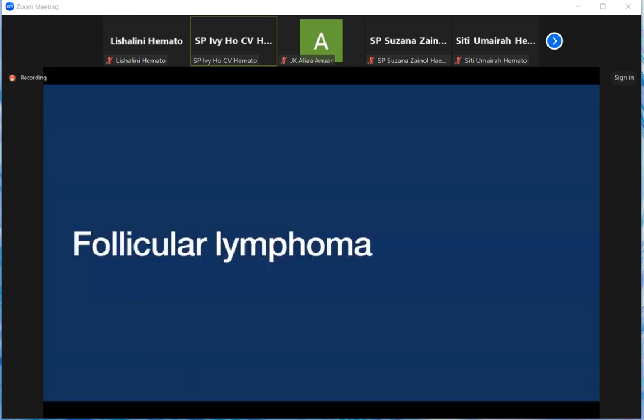Do you all need a break? My lecture is for 2 hours. The next one, the high grade one, might not be as long as the low grade one, so maybe I can give you a break for a while. We have talked about the normal pattern and the abnormal pattern of lymphoid infiltrate in marrow. I have gone through CLL and mantle cell lymphoma. I think we can stop for a while here. If you have any questions, you can ask me. Then we take a short break of a few minutes before I continue with the rest. Is that okay?